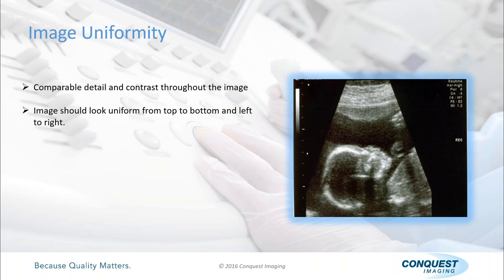Okay, so in this case, we have a pretty good image, but I have a question for us. What about these dark spots, like right here, this shadow, this dark spot? And there's one here too, where you just lose image. Is that a problem with the system? Is that a dropout? Oh, because if you see on top of that, it looks pretty clear. Right. Further down into the tissue, it's not getting that type of resolution. So in reality, would you think to associate that with the probe? And the answer is no. There's a reason for that.